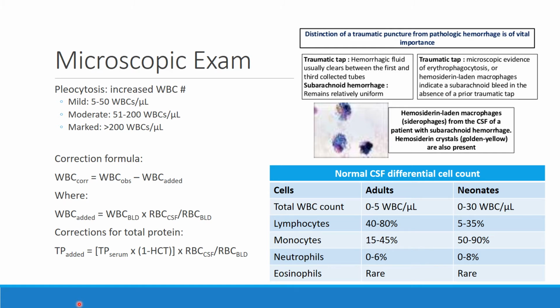The first thing that you're going to do is make sure that whatever tube you have is yours until you're done with it. You do your cell count. Remember, we're supposed to do it on tube number 3. You can't then say, well, I started it on tube number 3, but I ran out, let me go get tube number 1. It has to really be done all in the same tube in order to be accurate.